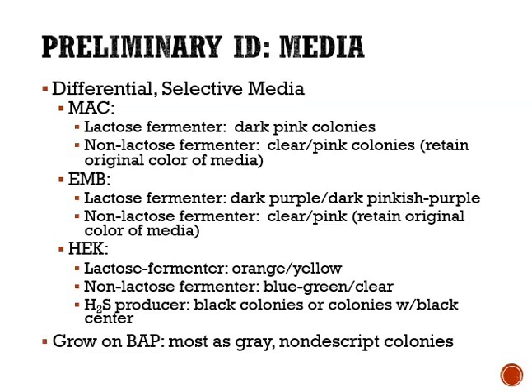Okay, preliminary identification. We're going to go through the different media, some of which we've already been through, and different testing methods that could help us identify these organisms. So first is our differential and selective media, which we've talked about since, I think, the very first lecture. These organisms utilize sugars in the media that cause color changes, which show the organism's ability to ferment the sugar. So this helps with our identification of these enteric organisms.